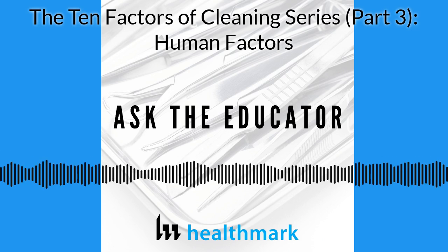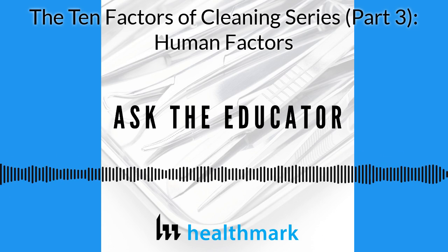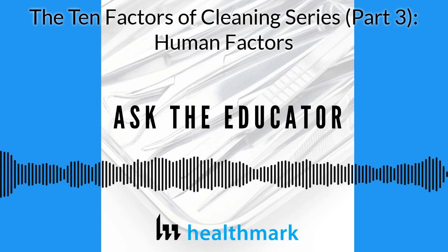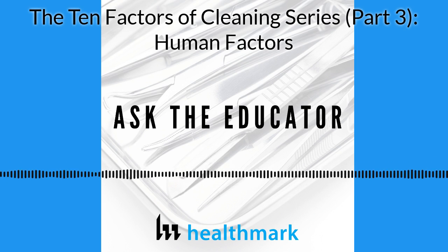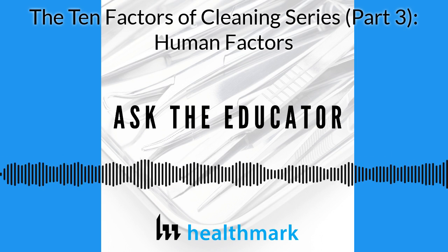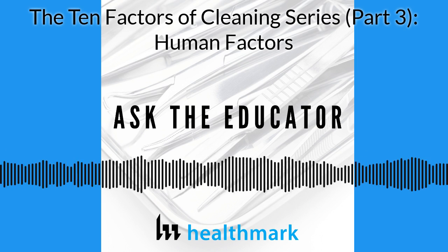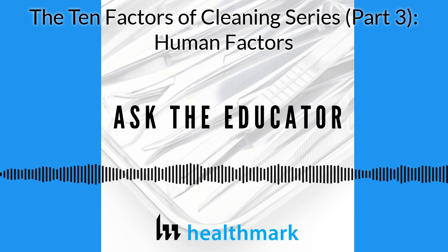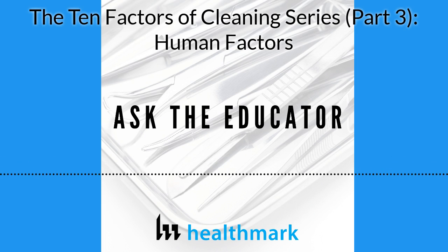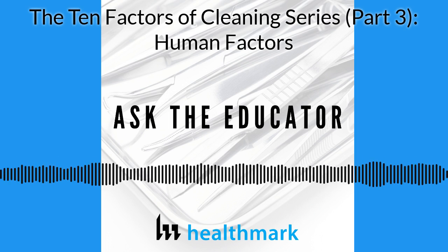What I wanted to also share with you, and we do work for HealthMark and so on, but a lot of times when both of us or all of us are called in, it's to do a cleaning audit. And what I like to do is I like to use our TOSI, the test object surgical instrument, on the orthopedic trays. And I don't think I've ever showed you some of the pictures I've taken, but I've actually put a TOSI on the top, on the outer layer, and on these multiple layers, put one on each layer and ran it through.